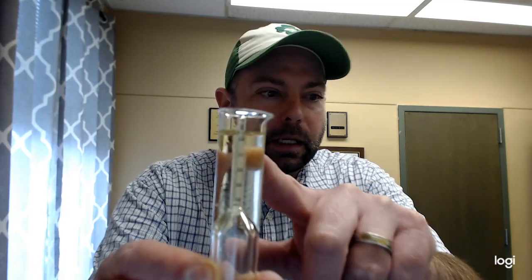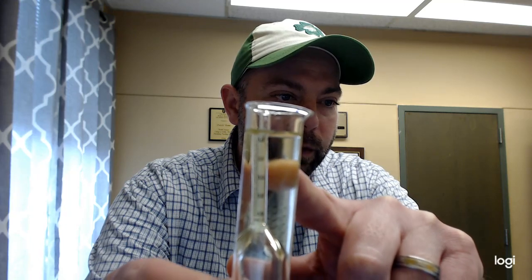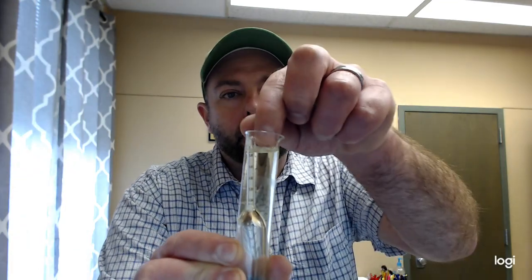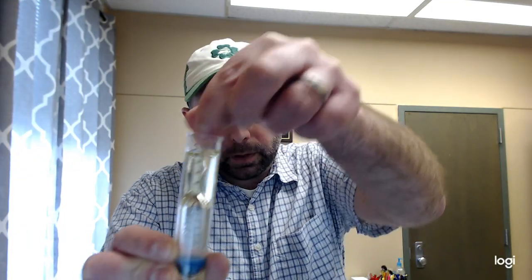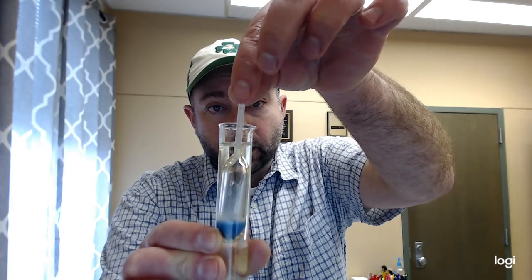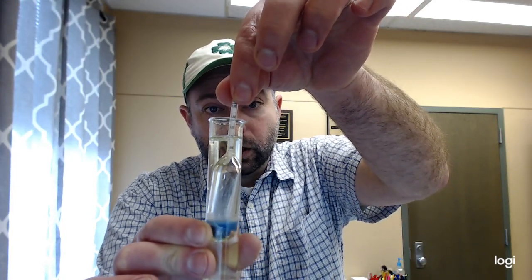Now, because this is just water out of the water fountain, you can see this one is not floating very deeply at all. It's hitting right at 1.0000. I know that's a little fuzzy, but that's the best my silly webcam can do there. You can see it. And it's going to float. The more dense this is, oh, I'm dripping on my desk again. The more dense this is, the higher up this thing's going to float, and you're going to read the number accordingly.